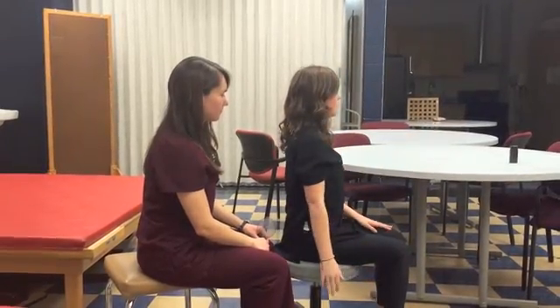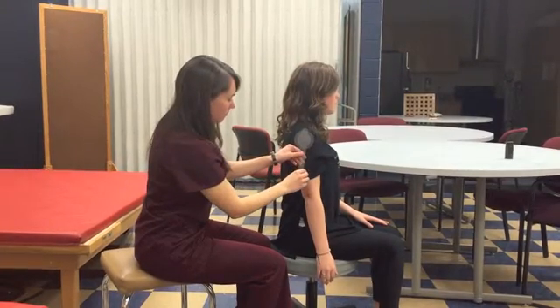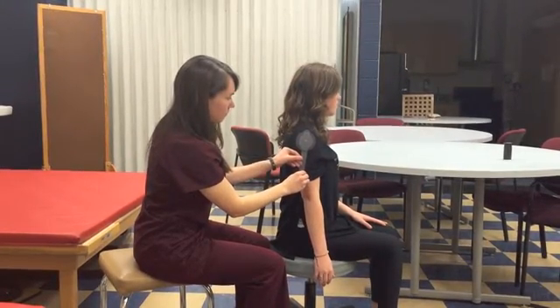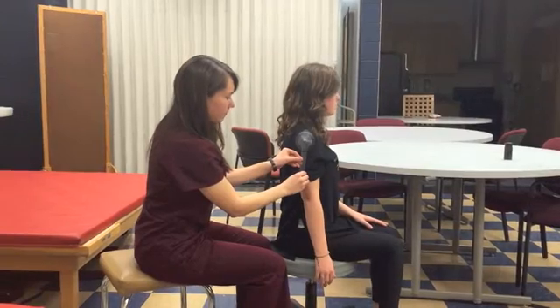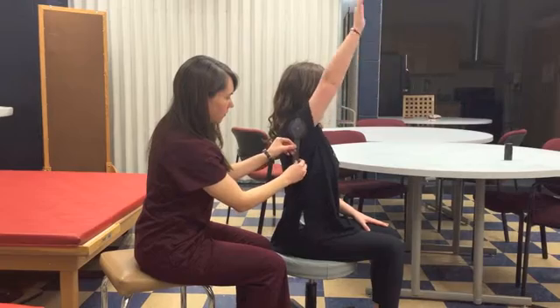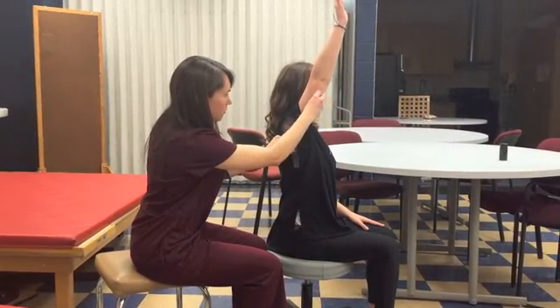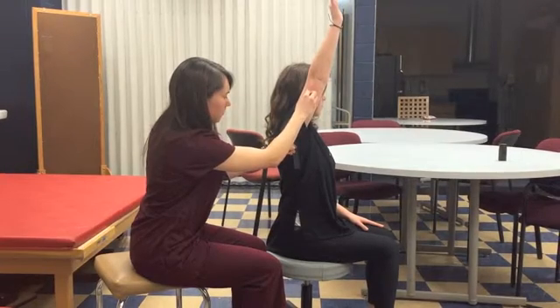Feel for the patient's acromion and place the axis directly under the acromion process. Record the starting degree range of motion. Ask the patient to perform the same movement as before, while moving the movable arm with the humerus, and complete the degree range of motion.